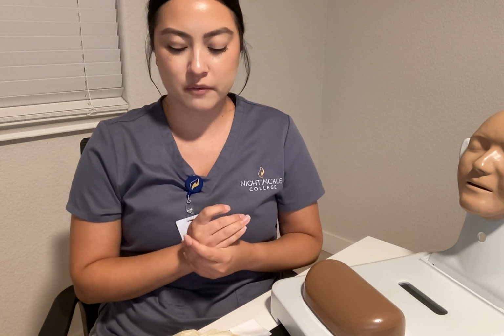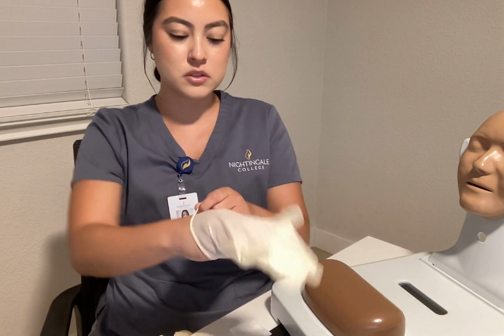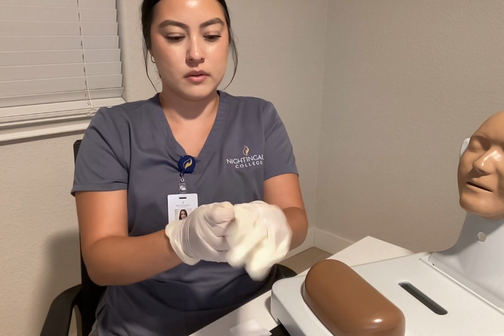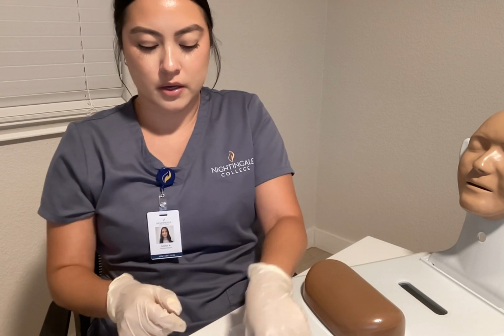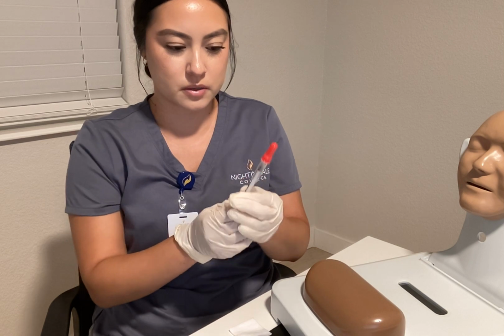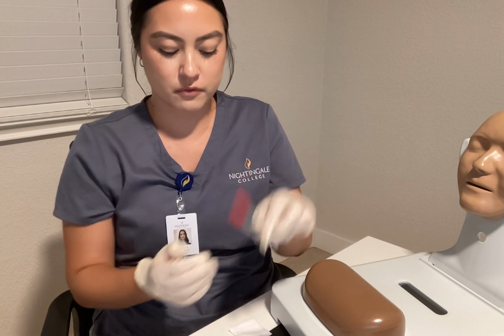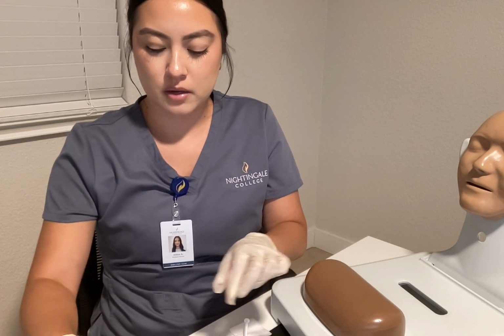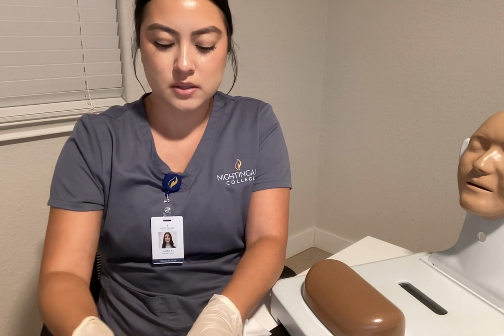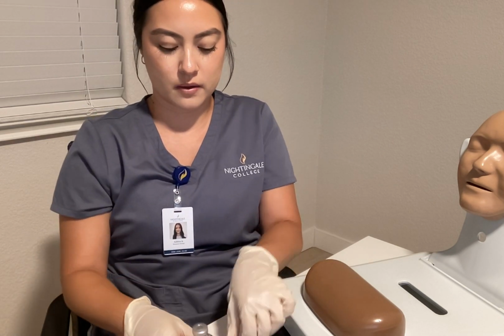No questions? Okay, perfect. So what we're going to go ahead and do is we are going to don our gloves. And we're going to go ahead and take out our needle and syringe, and we're just going to draw up again the 1 ml because we're going to be injecting with air first. So that's prepared. And then I'm going to take my alcohol wipe and we are just going to cleanse the top of the vial here. I'm going to throw that away.